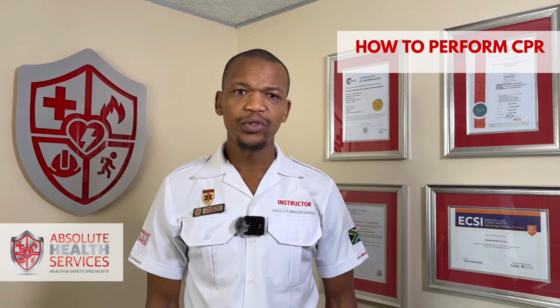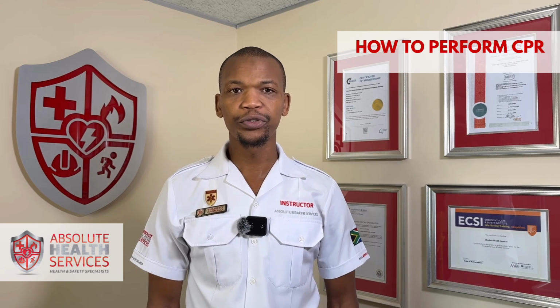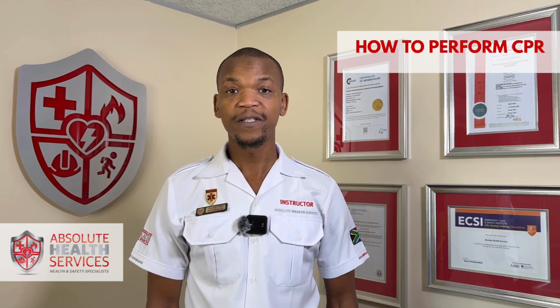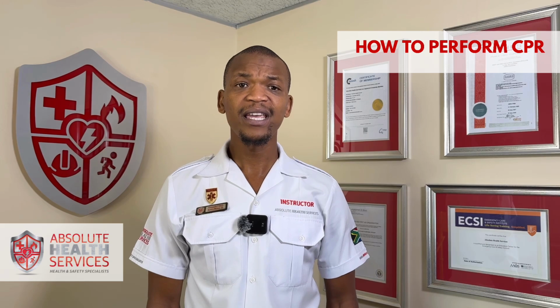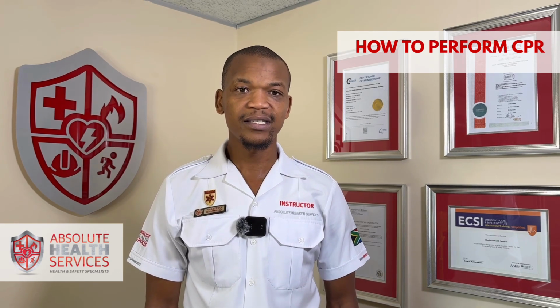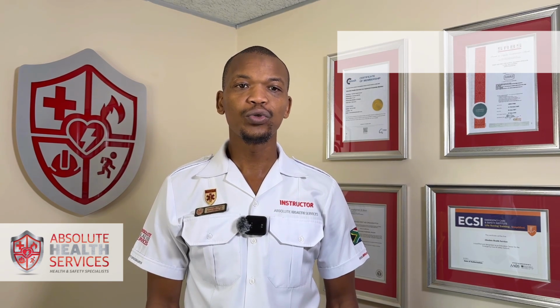So looking deeper now, how many compressions do we do? How many ventilations do we do? For how long do we continue to do this? We perform 30 compressions and 2 ventilations, and we repeat this for 5 cycles, which is equivalent to 2 minutes. Afterwards, we will then reassess. But should you have an AED machine, you will use the machine and you don't have to reassess. The device itself will assess every 2 minutes.